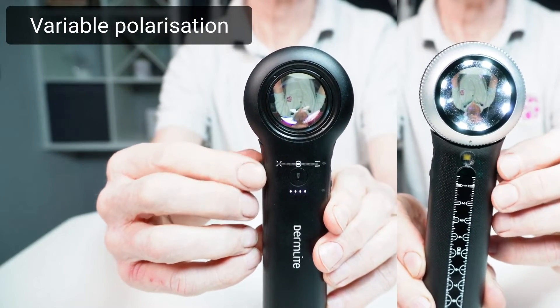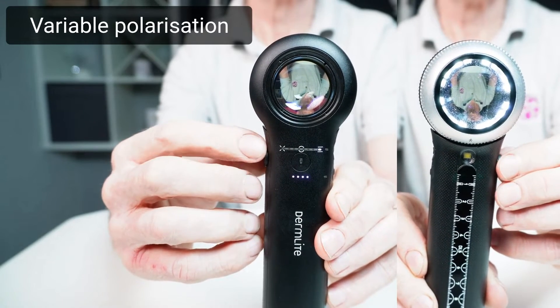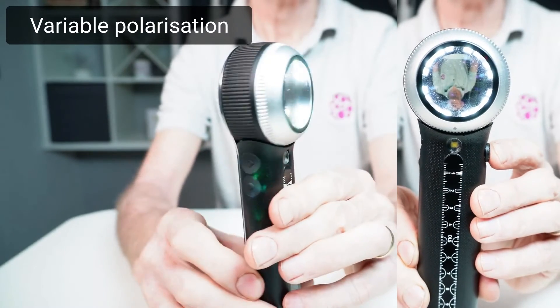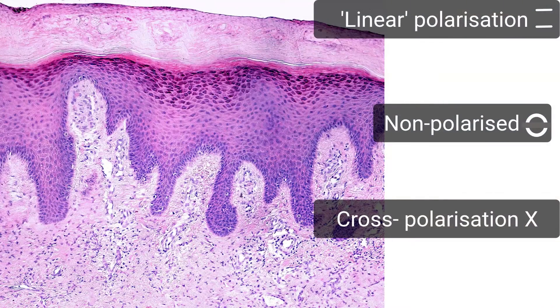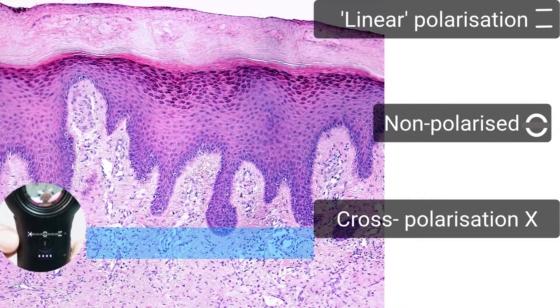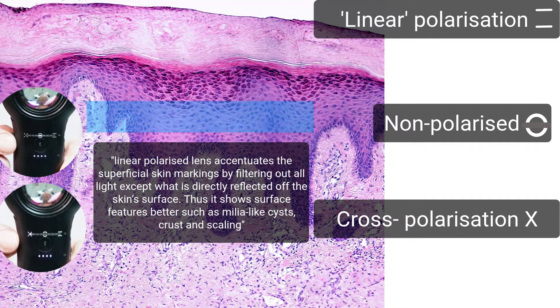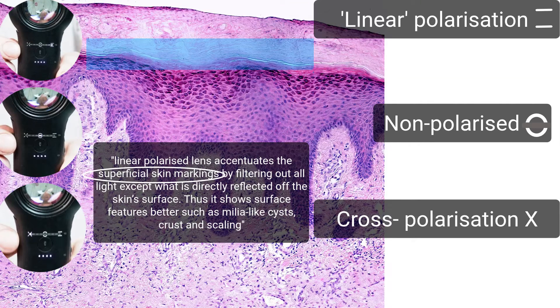Exploring its features. The X is for polarised light, the brackets for non-polarised. Rotating the off button when using the dermascope gradually shifts the light from fully polarised to non-polarised, then through to what's called linear polarised light. What this does is change your dermascopic view from a fully polarised one — ideal for deeper structures — up through the skin layers to the surface via non-polarised, all the way to the top surface in nine increments. The linear polarised lens accentuates superficial skin markings by filtering out all light except what is directly reflected off the skin surface, thus showing surface features better such as milia-like cysts, crust, and scale. I'll demonstrate this in practice when I compare my DL5 to the DL3 on a series of my patients.